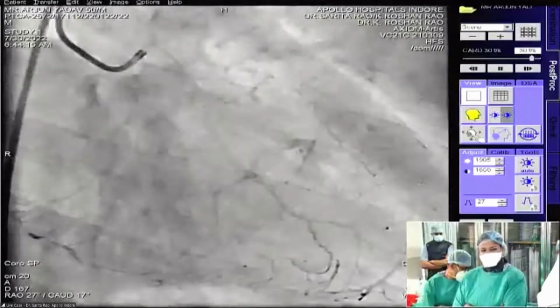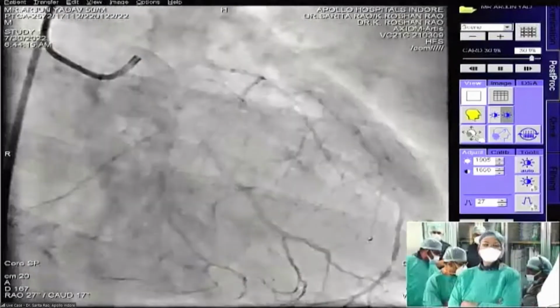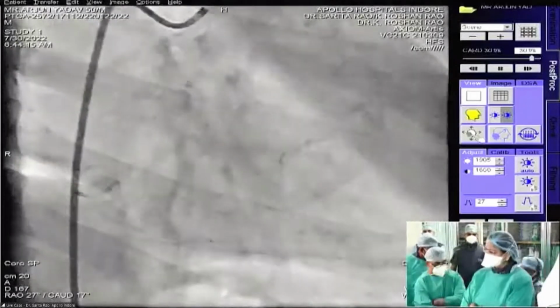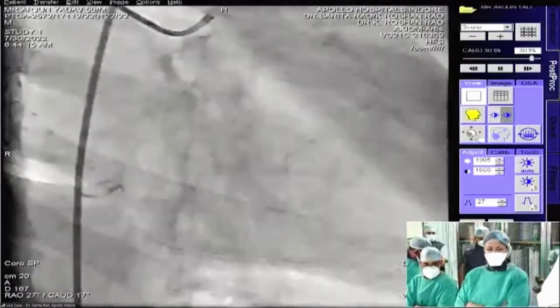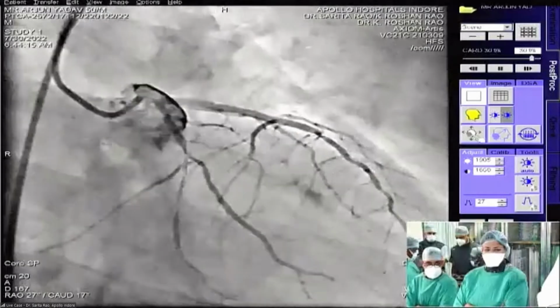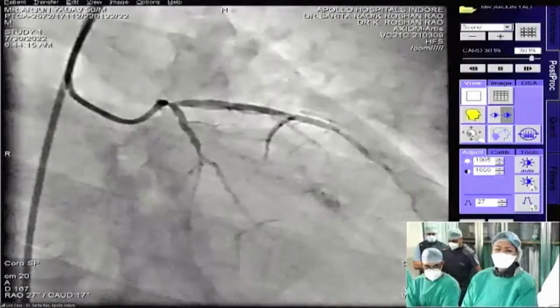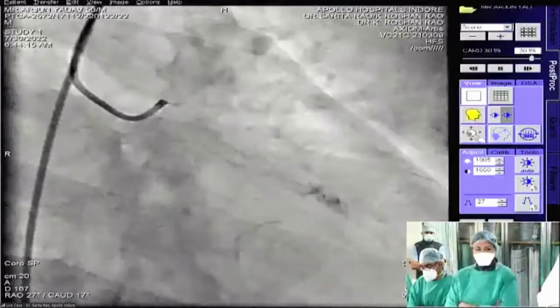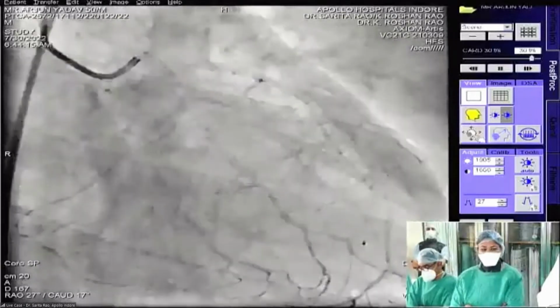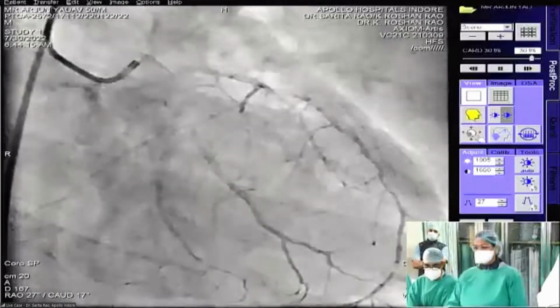So Dr. Sarita, you heard that, so questions are viability, and is the EF really 10% with the thick ventricle? Then what sort of mechanical circulatory support are you planning to do? And not to go for RCA CTO PCI as the first one, right? Yeah. So please tell us your approach. What are you planning?